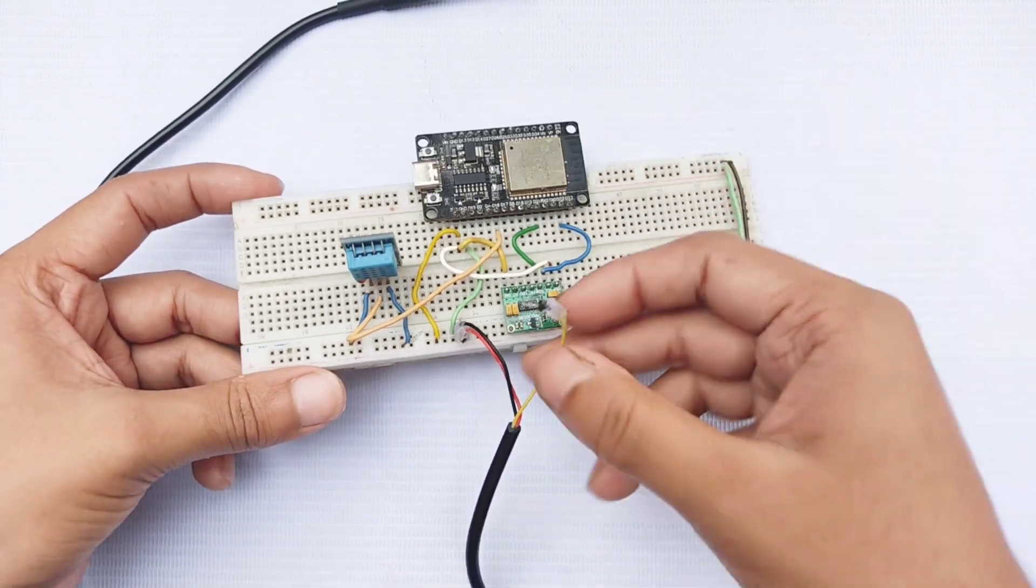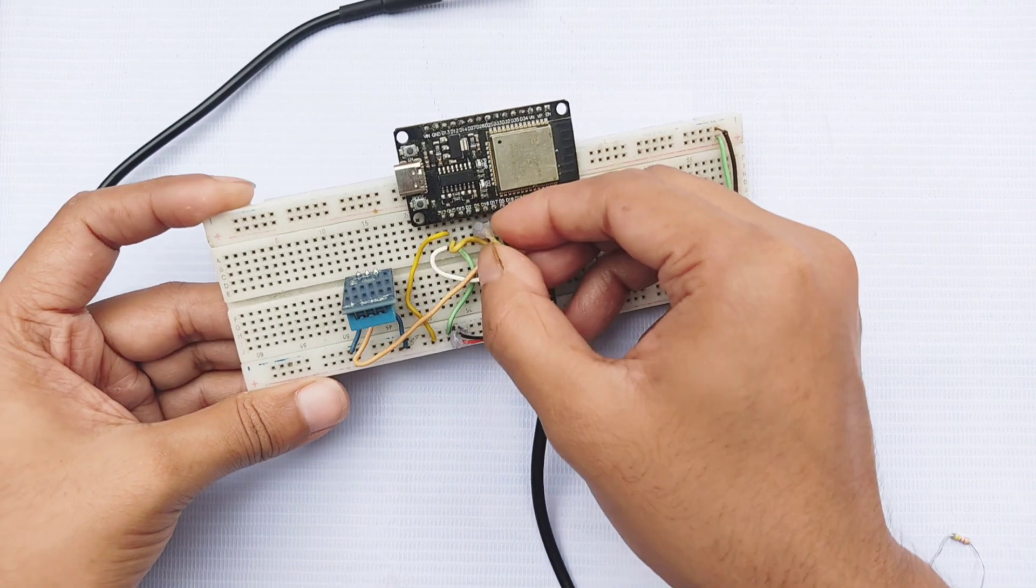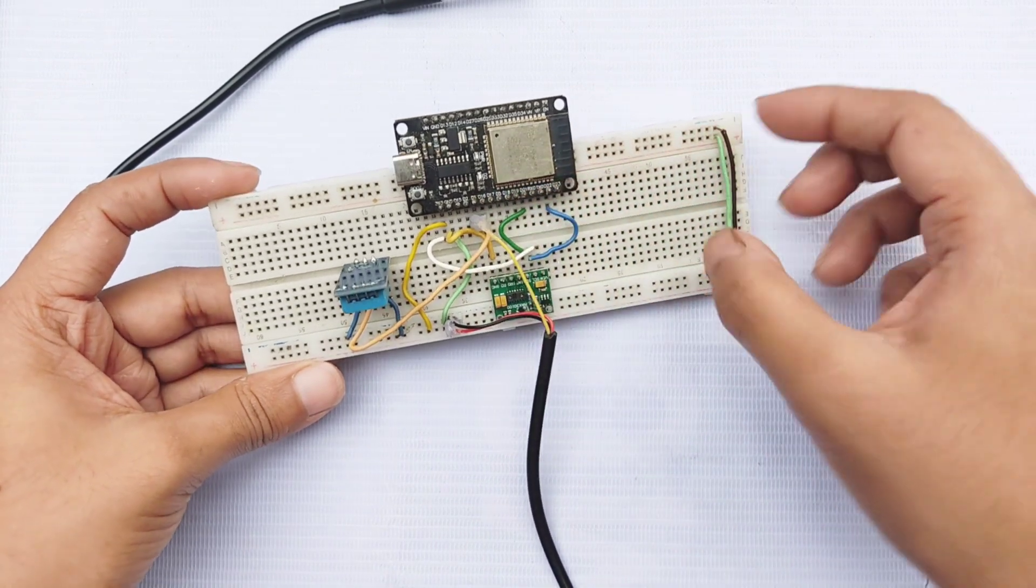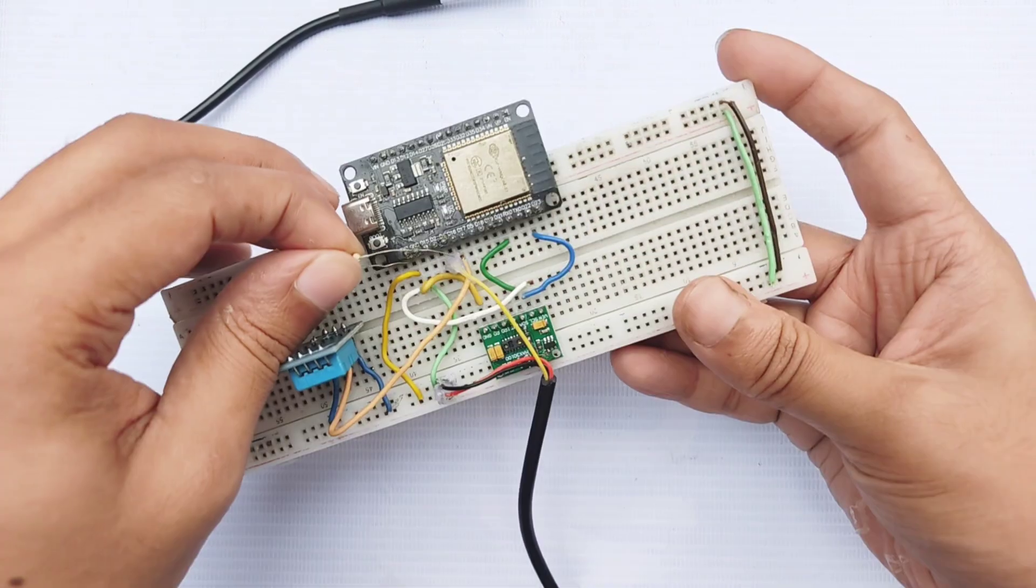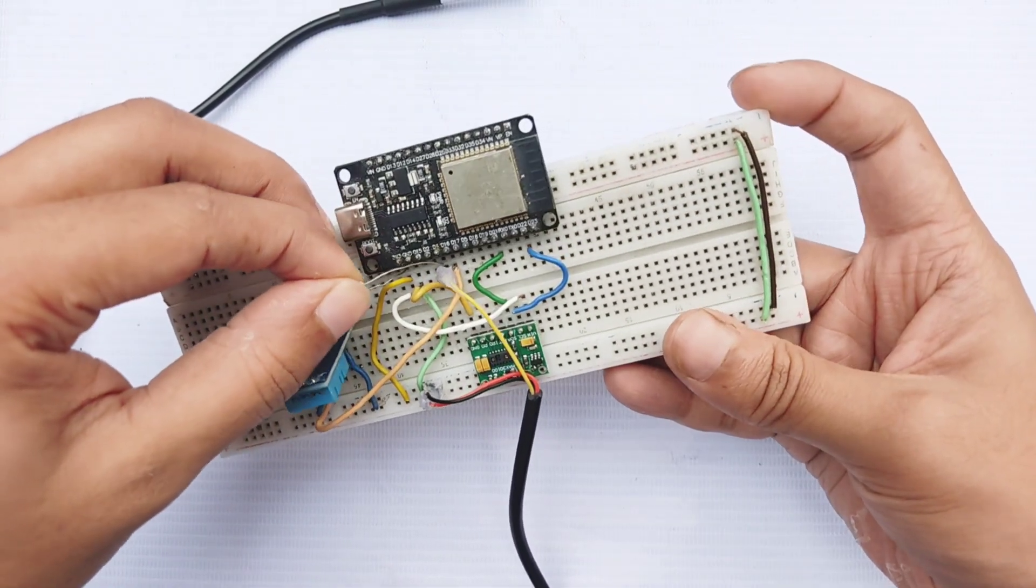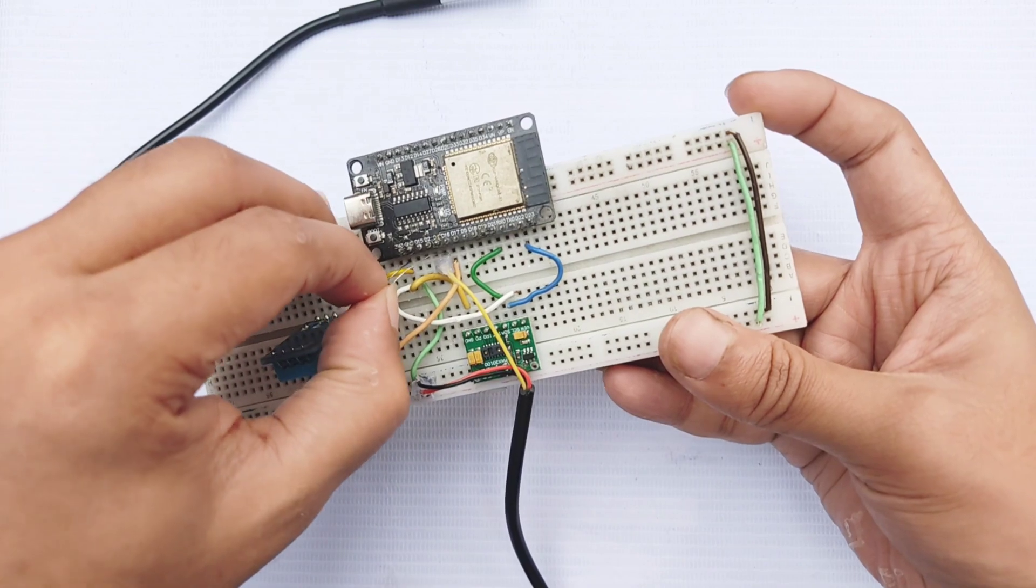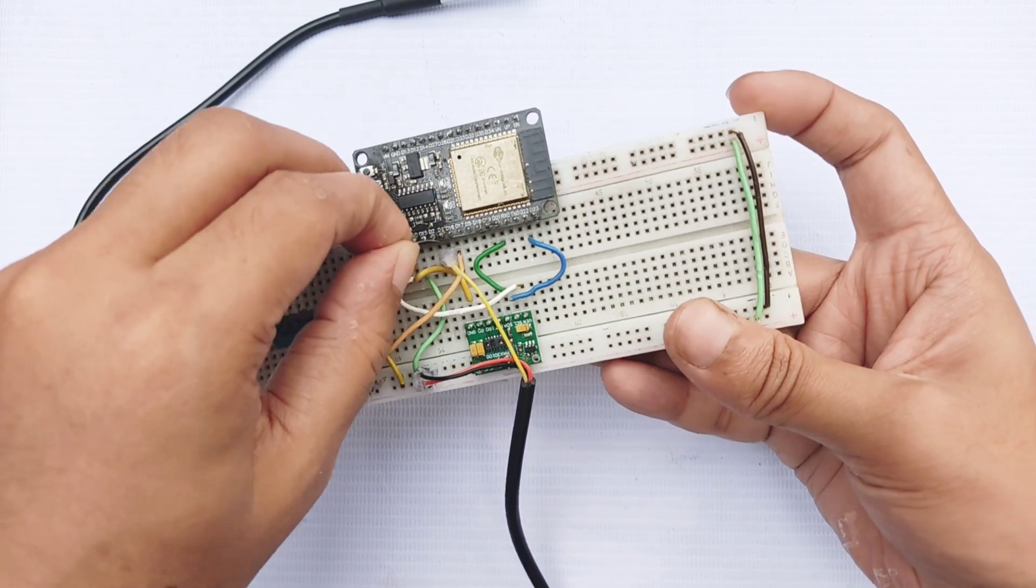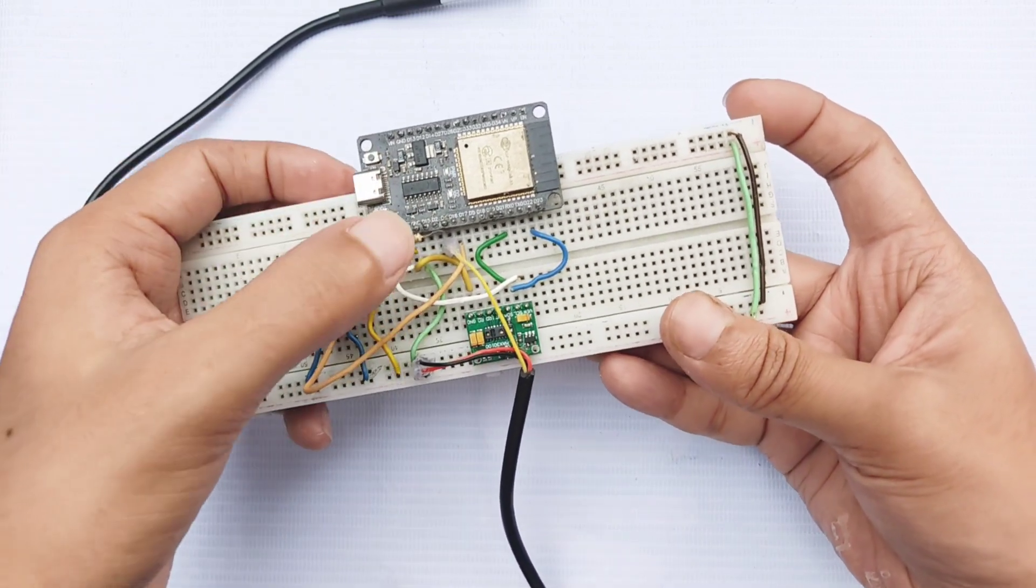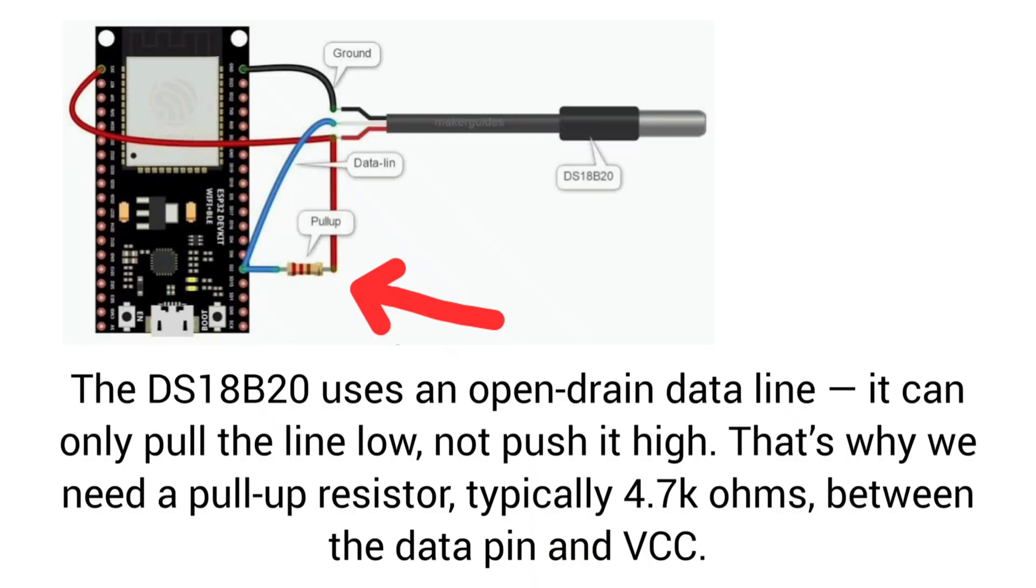Finally, connect the DS18B20 sensor and ensure that a 4.7 kOhm resistor is placed between the signal line of the sensor and the 3.3 volt pin of the ESP32. DS18B20 uses an open drain data line, which means it can only pull the line low, not drive it high. This is why a pull-up resistor is necessary to keep the line at a high state when the sensor is not pulling it low.